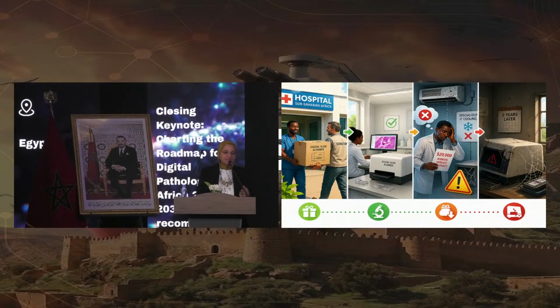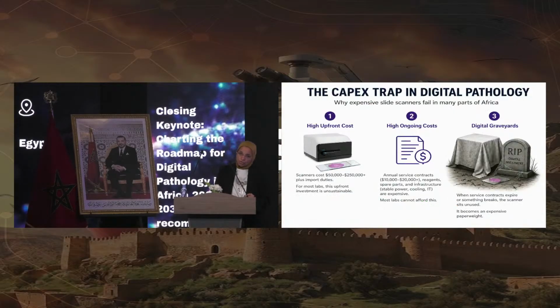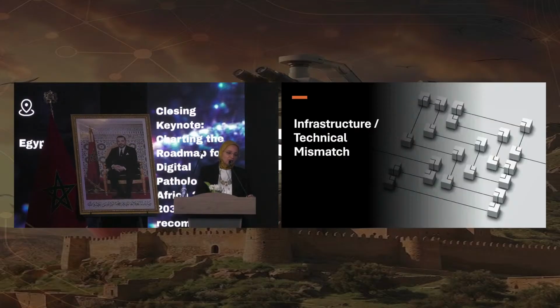So this is us, this is Africa. So the CapEx trap, as we call it, can make us end with a rest in peace format for our digital pathology session, which we definitely would not like to have. So this was as far as the financial mismatch has to do with.